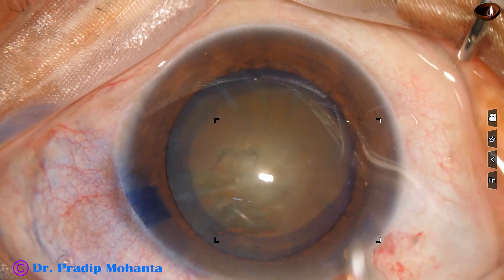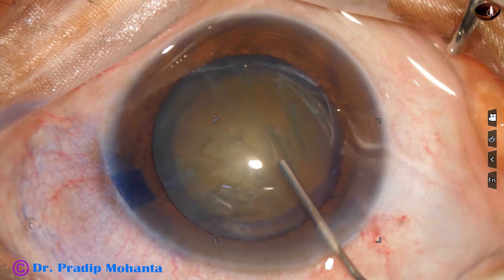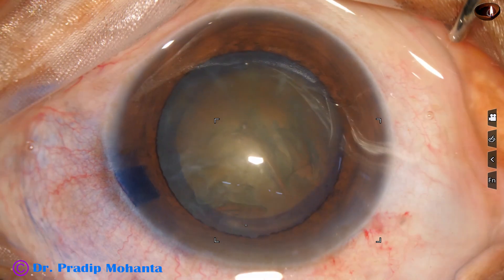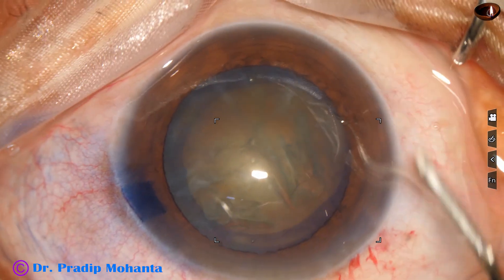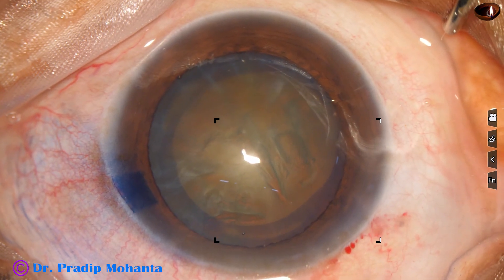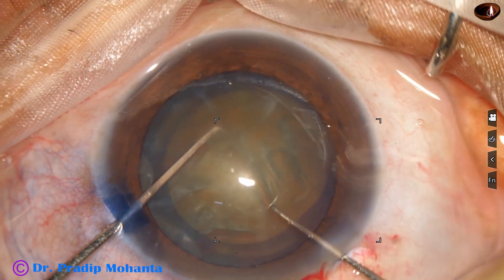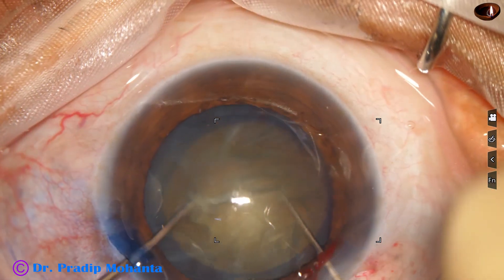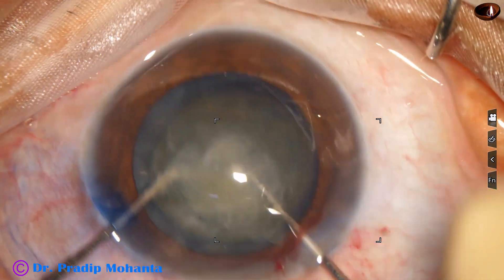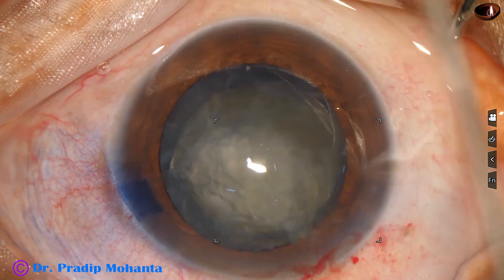Hydrodissection is done with a 27 gauge cannula and BSS. The nucleus is stabbed and the nucleus is rotated. This is a totally unedited recording and you are not missing anything. Rotating the nucleus bimanually so that stress on the zonules becomes less. The nucleus is free.